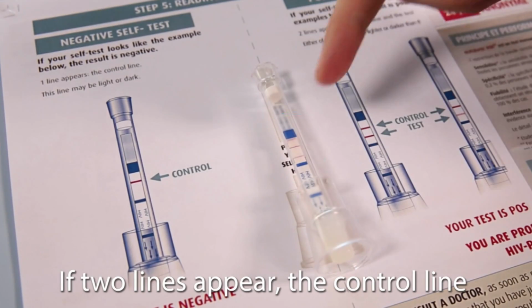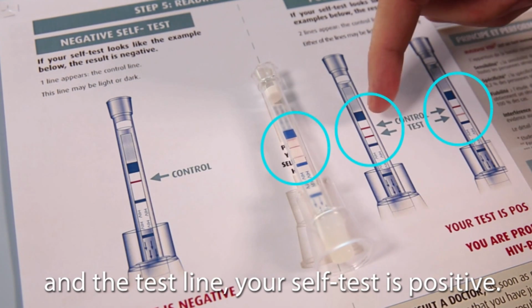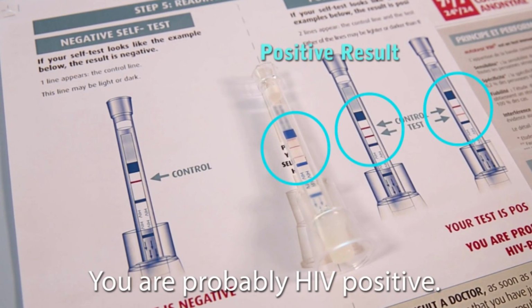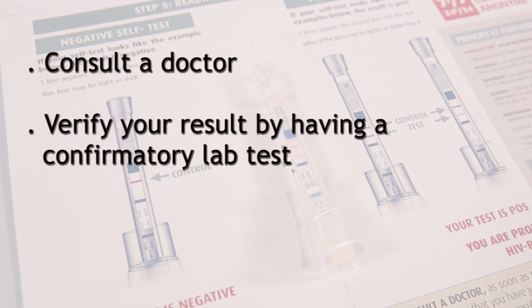If 2 lines appear, the control line and the test line, your self-test is positive. You are probably HIV positive. You have to verify your result with a confirmatory lab test and to consult a doctor as soon as possible.